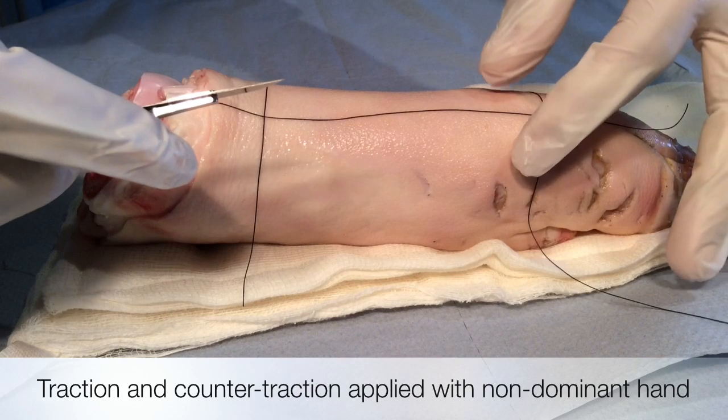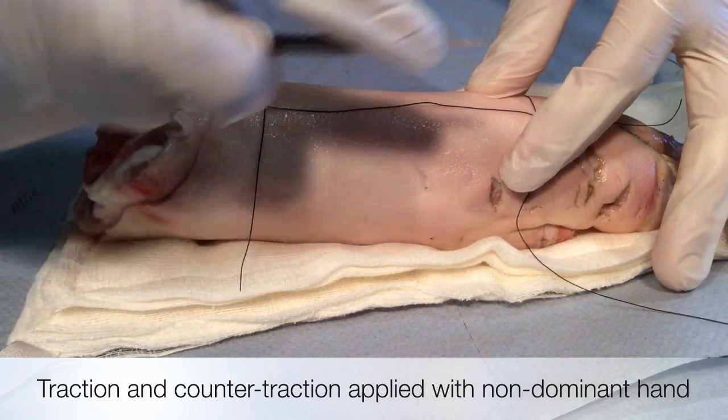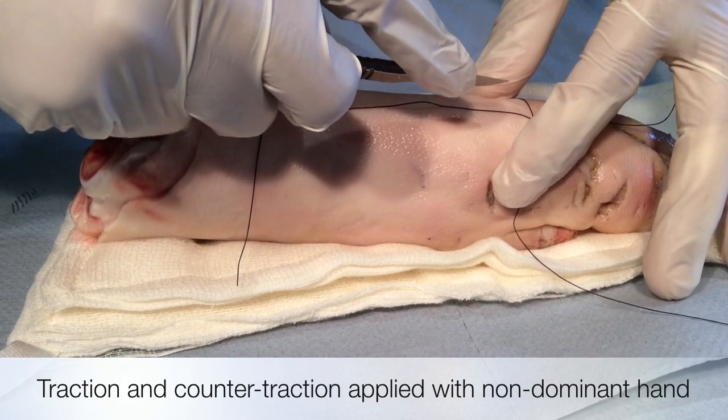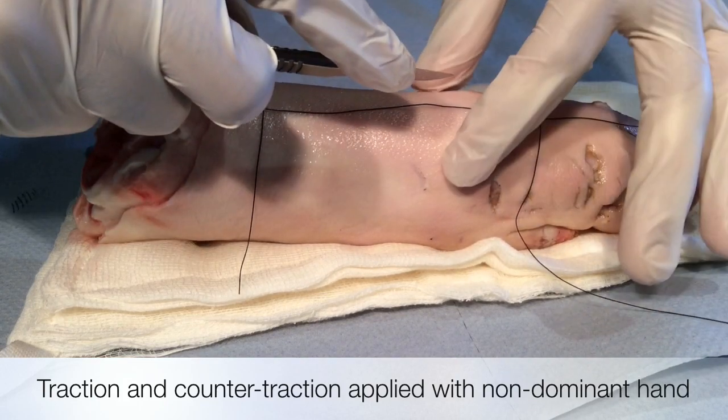When you make the incision, with your non-dominant hand, you must apply equal pressure on either side. This is called traction and counter-traction.